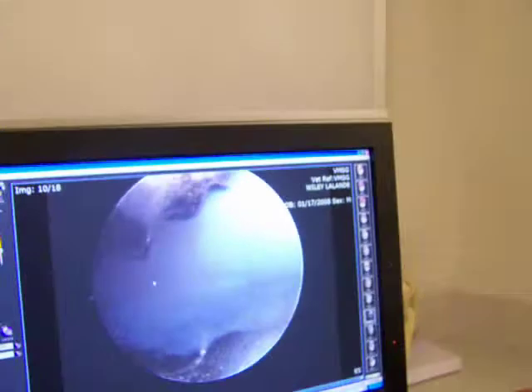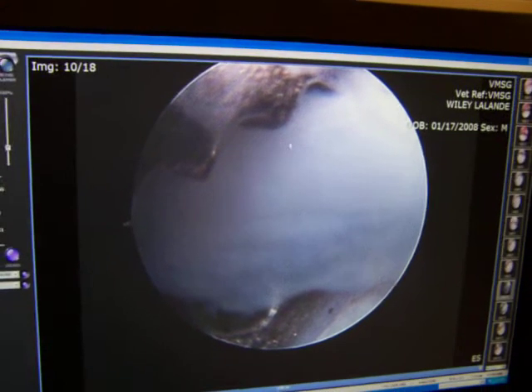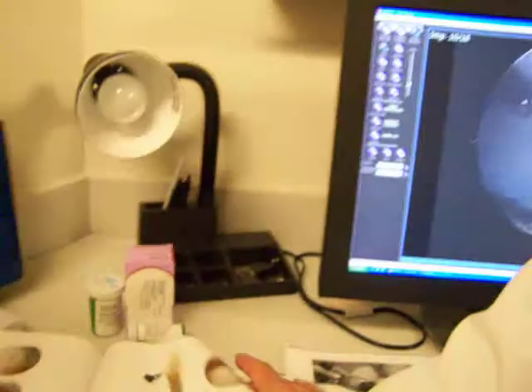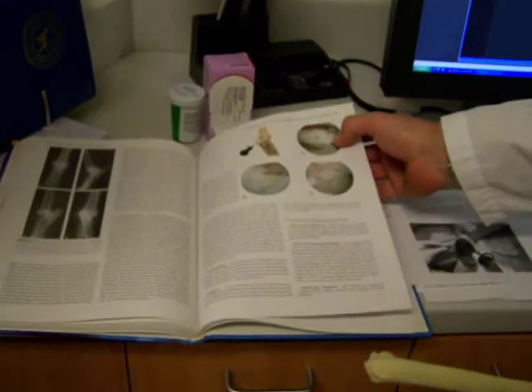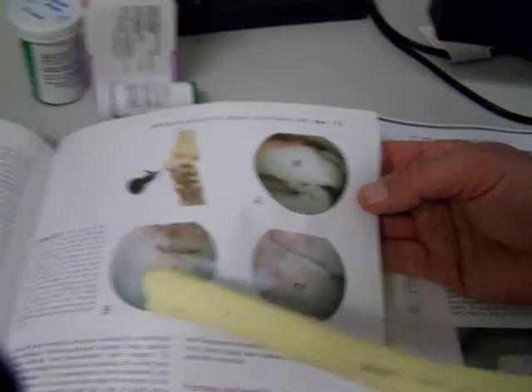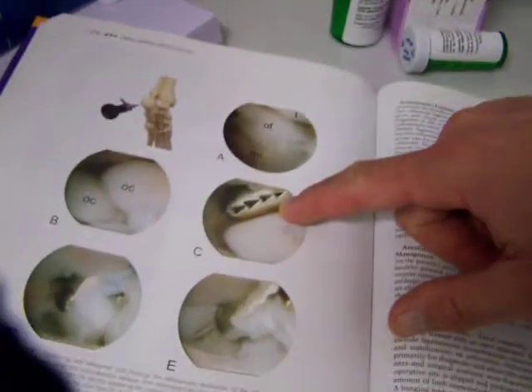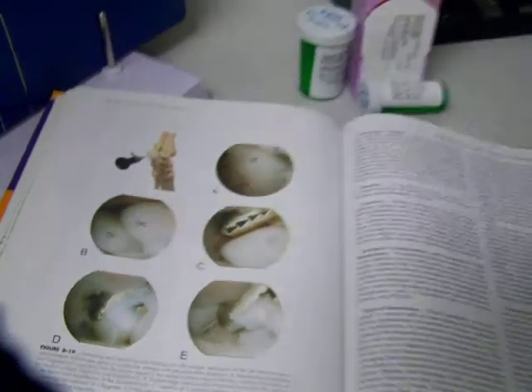This is actually the jaws of my instrument coming in — I'm grabbing the flap, right on top of it, that's why it's so close. I'm grabbing that flap in the jaws. There's a clinical case shown in this textbook as well — see there's one of the flaps, this is another case. See how that flap is elevated right up? Yours hadn't elevated so far.